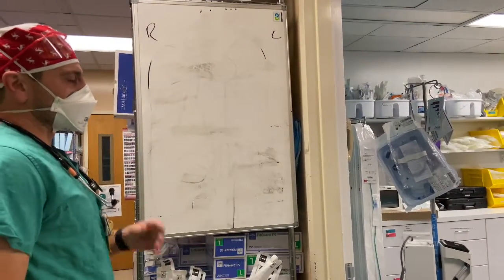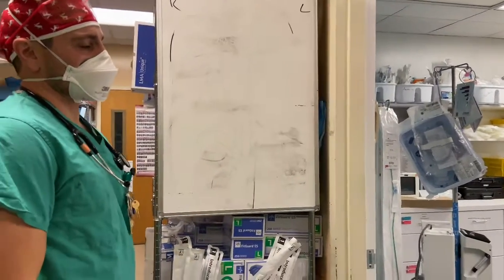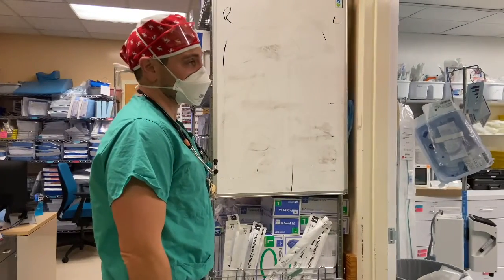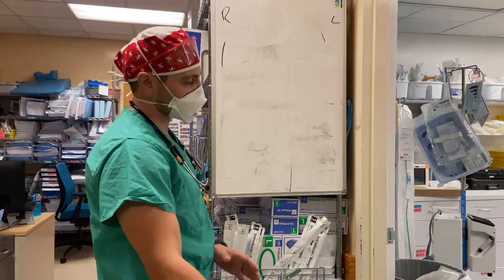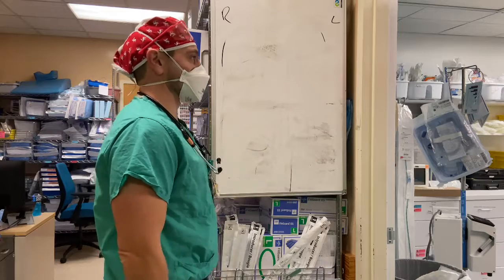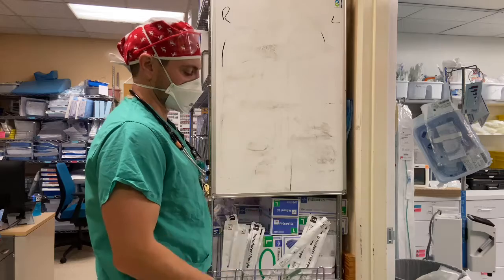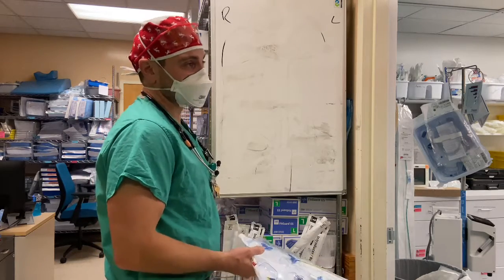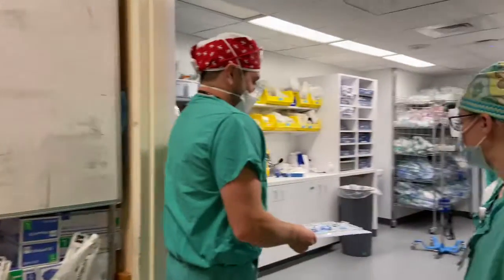Okay. So positive pressure, negative pressure, endotracheal tube, LMA, and then lung isolation, really for the surgeon to be able to see what they need to see, and for us to selectively ventilate one side versus the other. And then double lumen tube versus bronchial blocker, based on ease of using the double lumen tubes, ease of getting the lungs to deflate, versus these, when we get scared we can't intubate, or wouldn't be happy if we extubated. Okay? That's kind of an oversimplification, but all right. Hopefully that was helpful, guys.